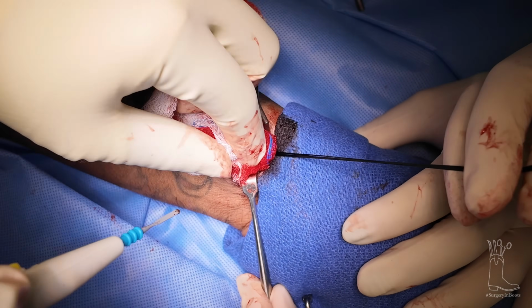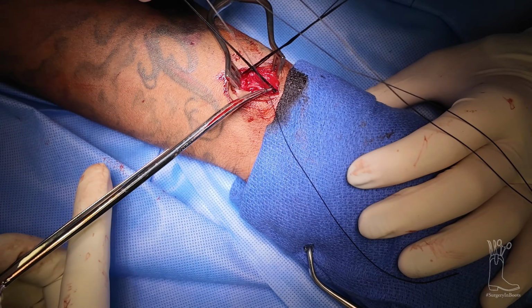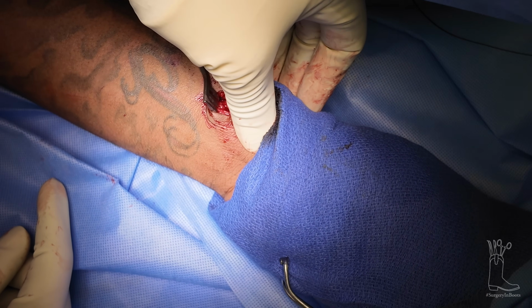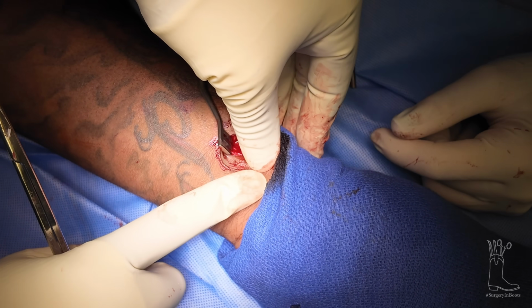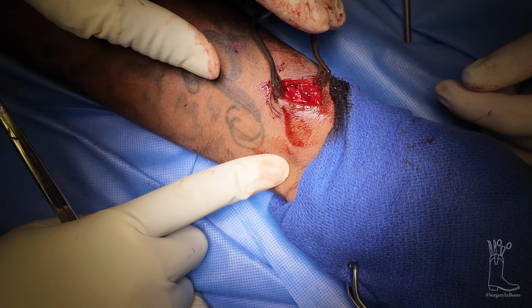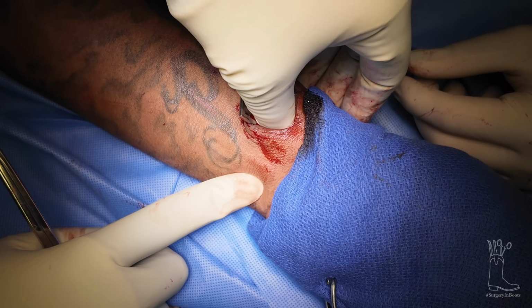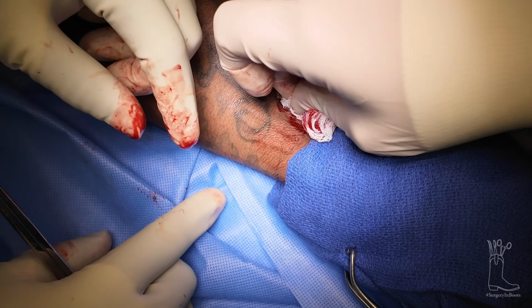So there is no more bleeding, so all with these scissors, got them. Cut that off, cut that off, cut that off. And the most important thing is got to make sure that my man has a pulse. He does there. And he does there. So yeah, we're just gonna close that up. And that's it.